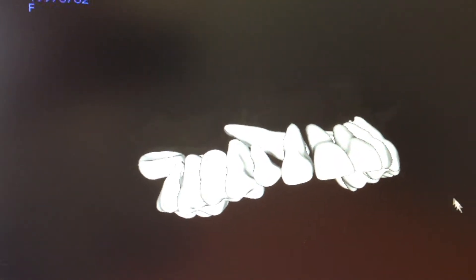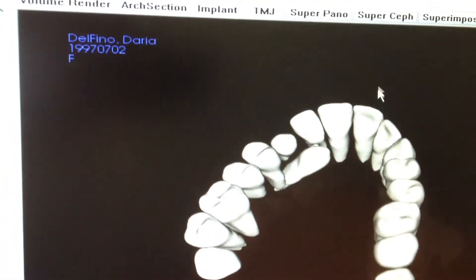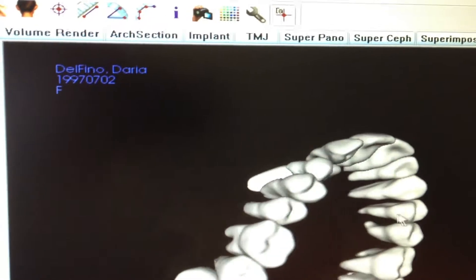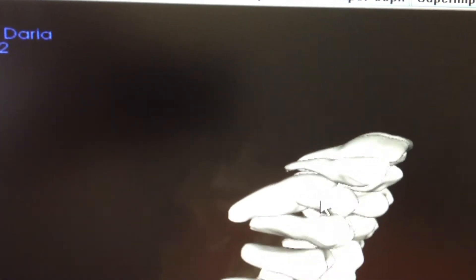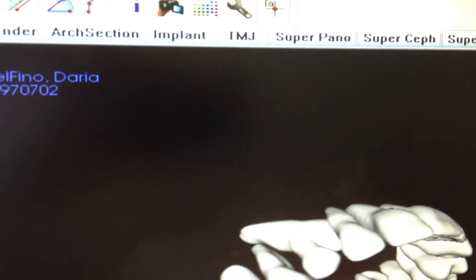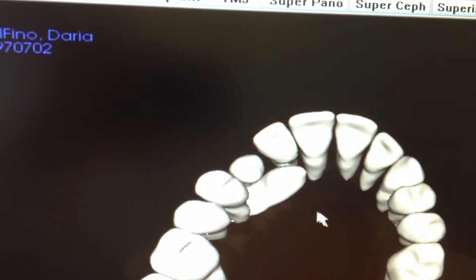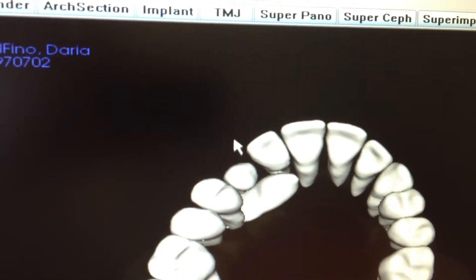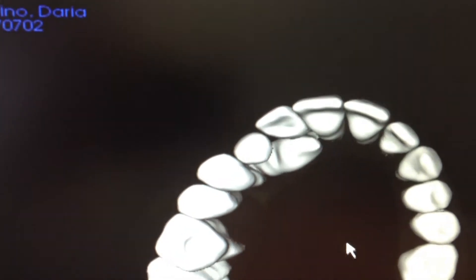Continuing from the previous discussion on impacted teeth and cone beam imaging — this tooth had significant resorption and damage from not diagnosing early enough the direction of eruption. We have a very poor prognosis and long-term survivability for this front lateral incisor. So we know we have to pull the tooth away from this root as a key mechanical direction.